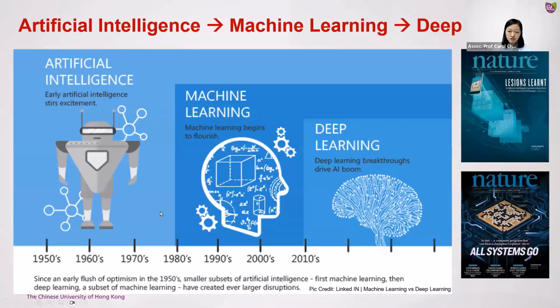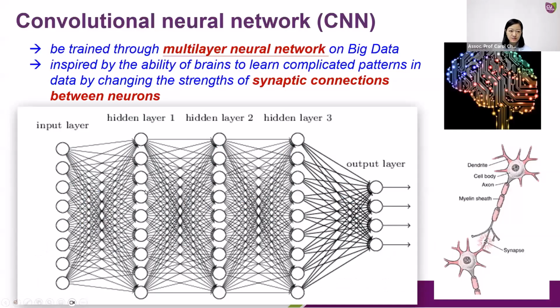Regarding the gaps that no current measures are specific to AD, AI has great potential to address them. In the last few years, deep learning technology, which is under the umbrella of AI, has developed rapidly and is a major area of future research in the analysis of medical images to transform healthcare, focusing on image classification and pattern recognition. Indeed, Raymond and Cheung are also experts in AI in ophthalmology.